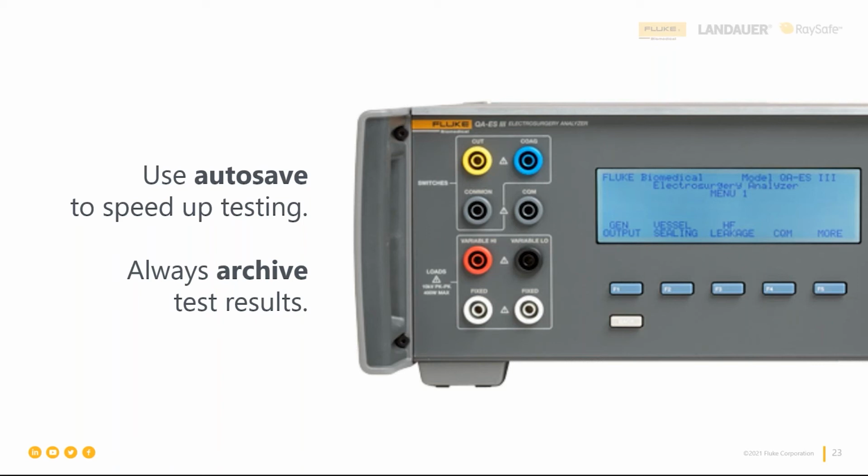The other thing that's really nice about it is that when you use that automatic feature, it holds the value on the screen of the QAS3. Why this is important to know is because there's a duty cycle for the ESU and a duty cycle for the QAS3.